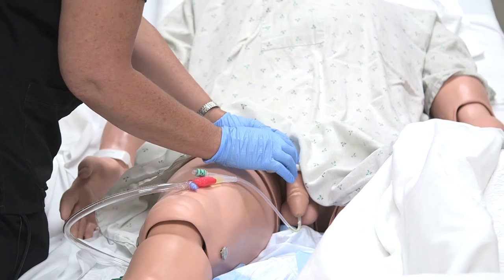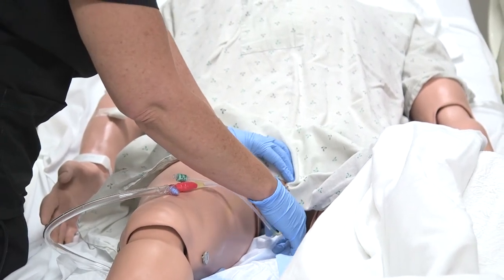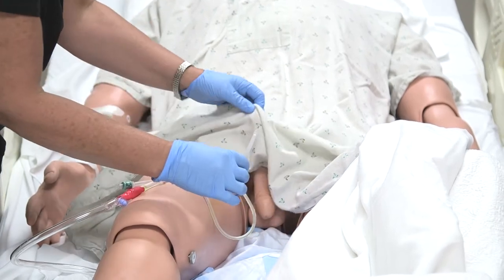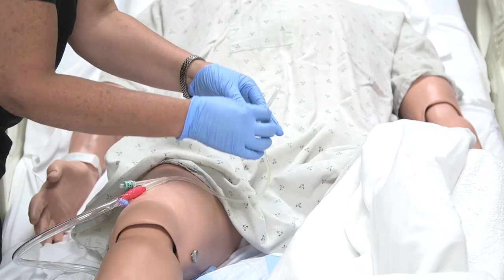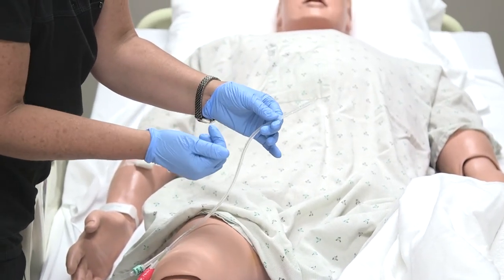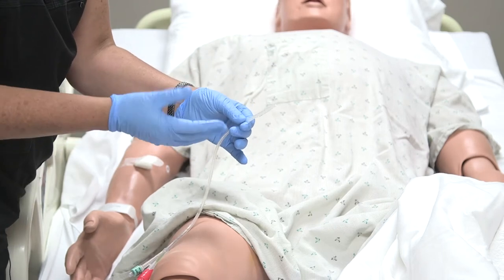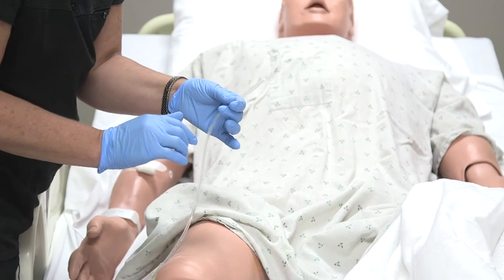This is pretty simple. I'm just going to have you take a deep breath, and when you blow out, I'm going to start pulling out the catheter. In deep and blow out. That's all there is to it. We would also do peri care when we're done, to make sure everything's clean. You want to examine the end of the catheter tip to make sure it's intact — so there aren't any pieces left in the bladder — and look for any drainage or anything abnormal, because you could culture the tip if necessary.